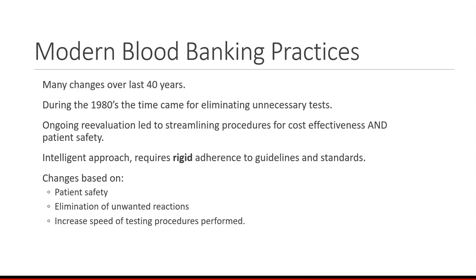So this intelligent approach requires rigid adherence to the guidelines and standards that exist to this date. The changes were based on, number one, patient safety. Number two, elimination of unwanted reaction. We used to have to set up 2 sets of screens. One was incubated at room temperature. The other one, we had the enhancement reagent, then it was incubated.